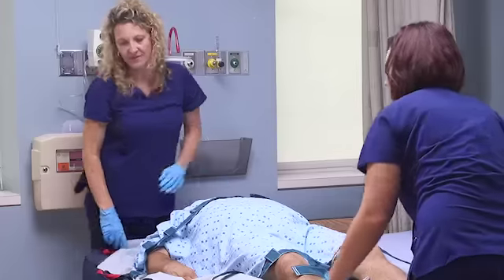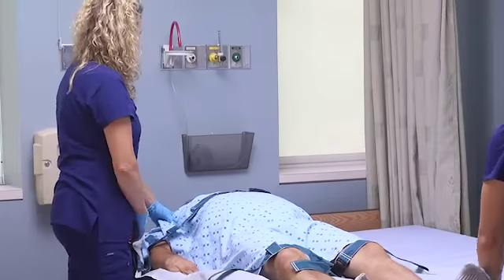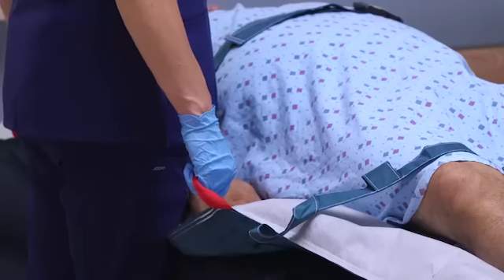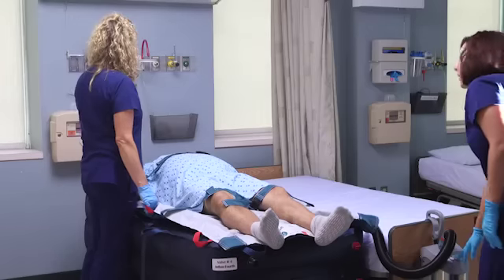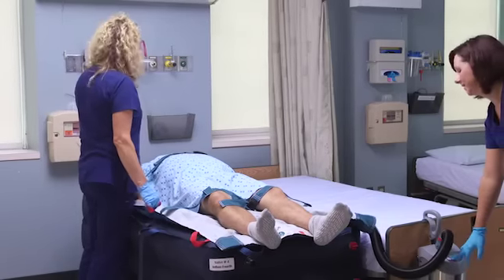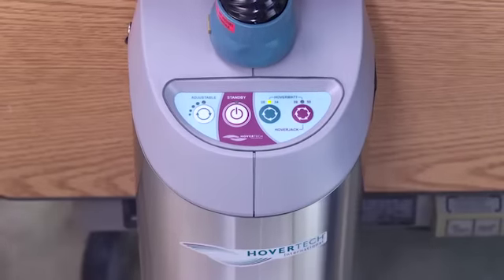Detach the HoverJack safety straps and insert the air supply hose into the HoverMat hose entry closest to the receiving surface. The caregiver at the head end will move to the side of the HoverJack, assume the position of safety, advise the patient of inflation, and ask the caregiver at the foot end to inflate the HoverMat. Select the appropriate air supply inflation button for the HoverMat model in use.